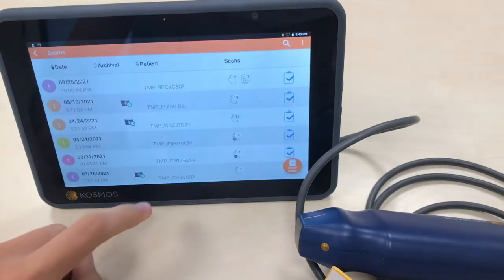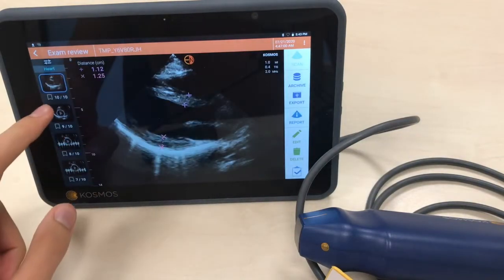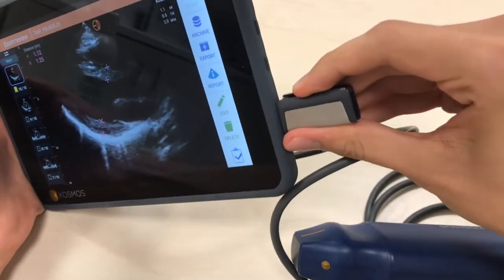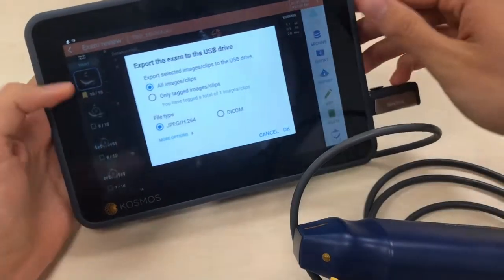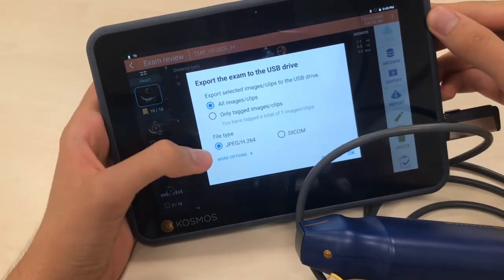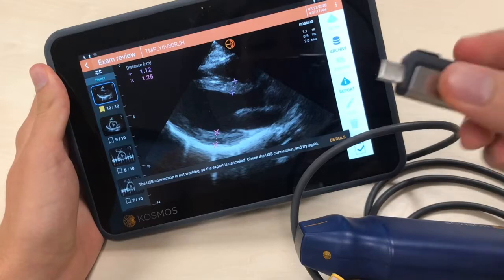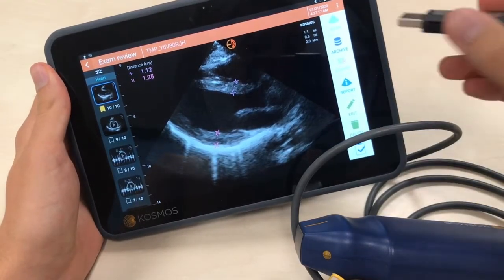To export the images, you just select the images you want to export — for example this one — and you plug a USB drive into the USB-C port. Then you click here, and you can select all images in the left column or only the tagged ones, and choose the file type. You click OK and it has already exported. You now have them on the USB drive, and you can also switch the USB-C to connect to a computer.